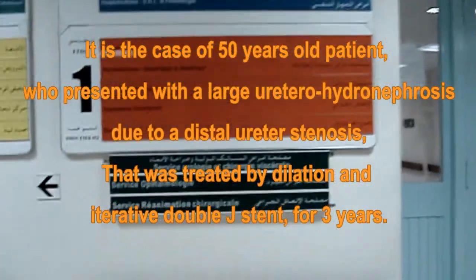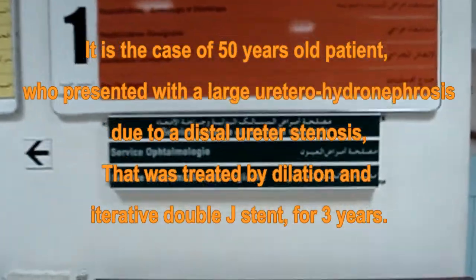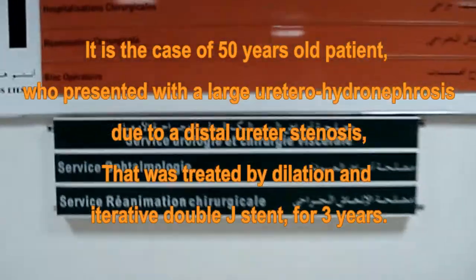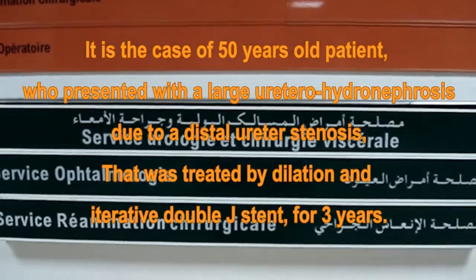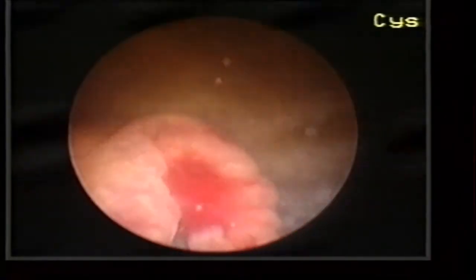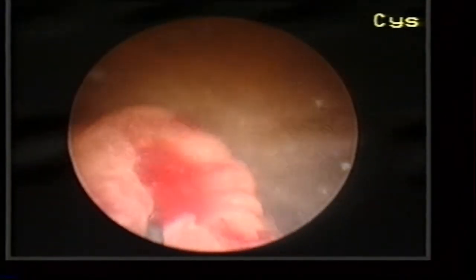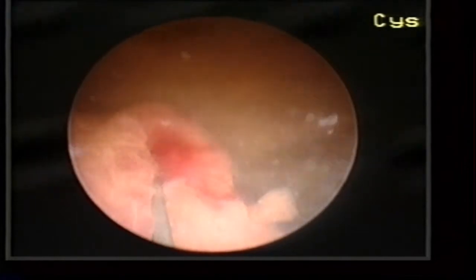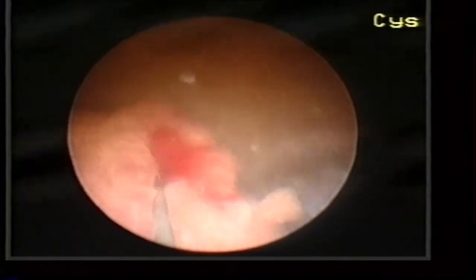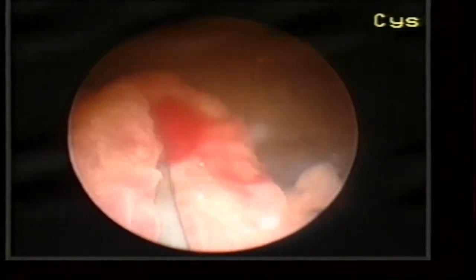The stenosis was treated by dilation and iterative JJ stent for three years. The cystoscope is introduced, the JJ stent is removed, and the guide wire is inserted. The ureteroscope is introduced and progression to the stenosis is performed.